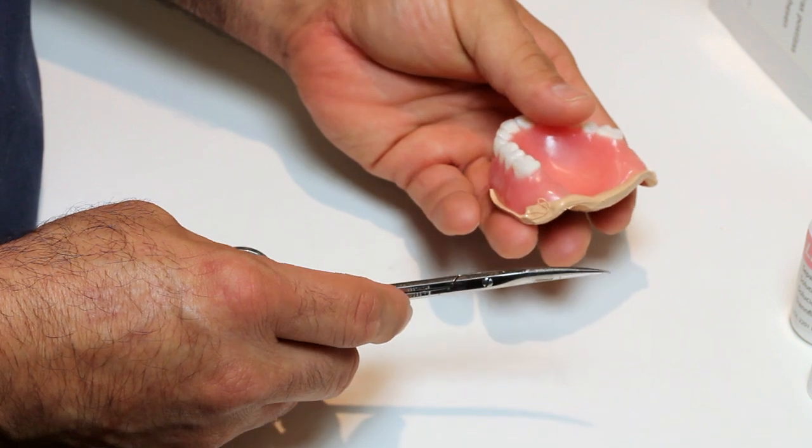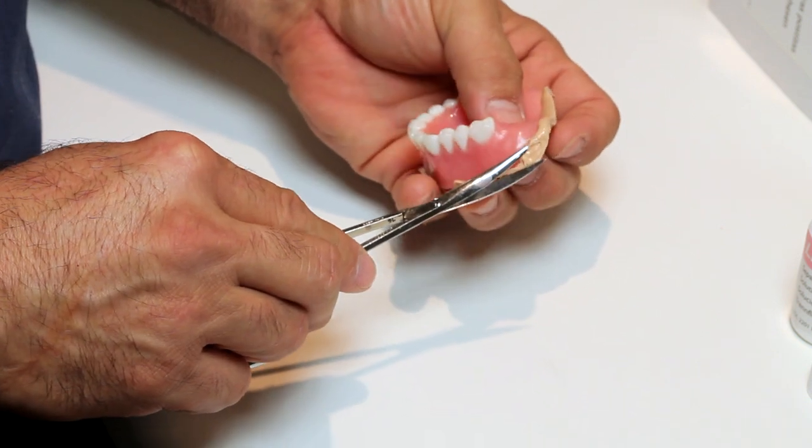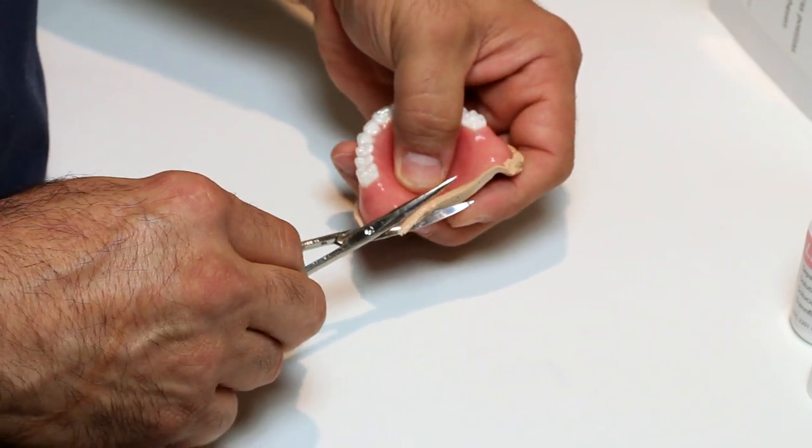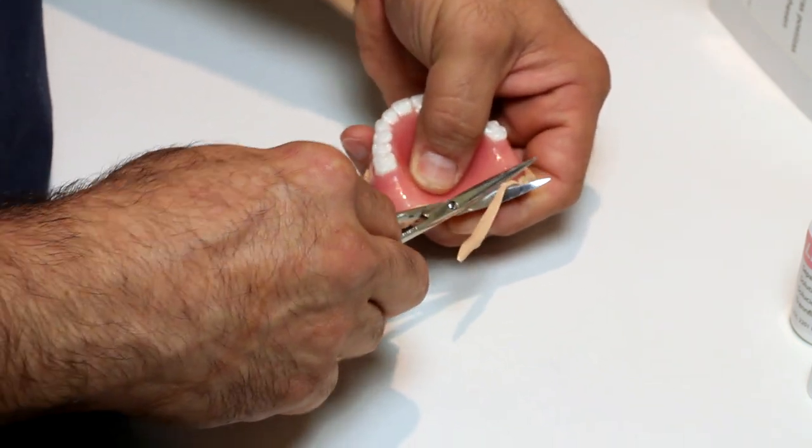Upon receiving an impressed upper or lower denture for relining, trim the excess impression material around the perimeter of the denture to make for a cleaner process.